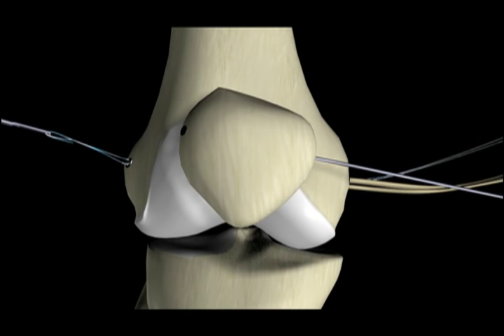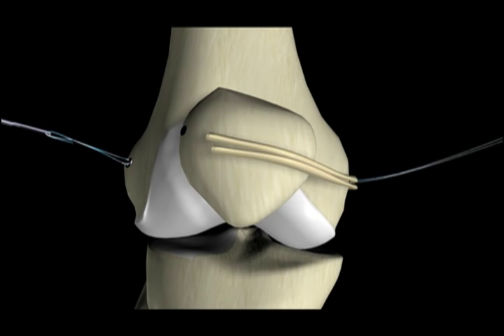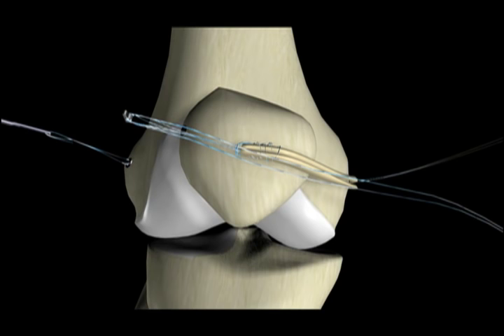The graft is passed from the medial femoral incision to the anterior medial patellar incision underneath layer 2. The graft limbs are re-measured from the point of insertion into the medial patellar tunnel and trialed with varying amounts of MPFL length. New sutures are placed in the two free limbs for a distance that matches the length of the acorn-reamed patellar tunnel, and the remaining excess graft and initial tension stitches are cut away.